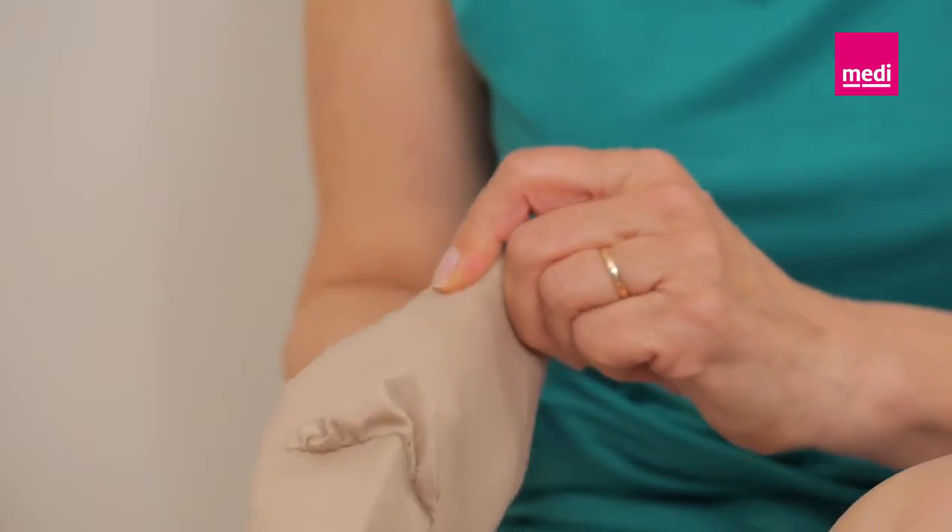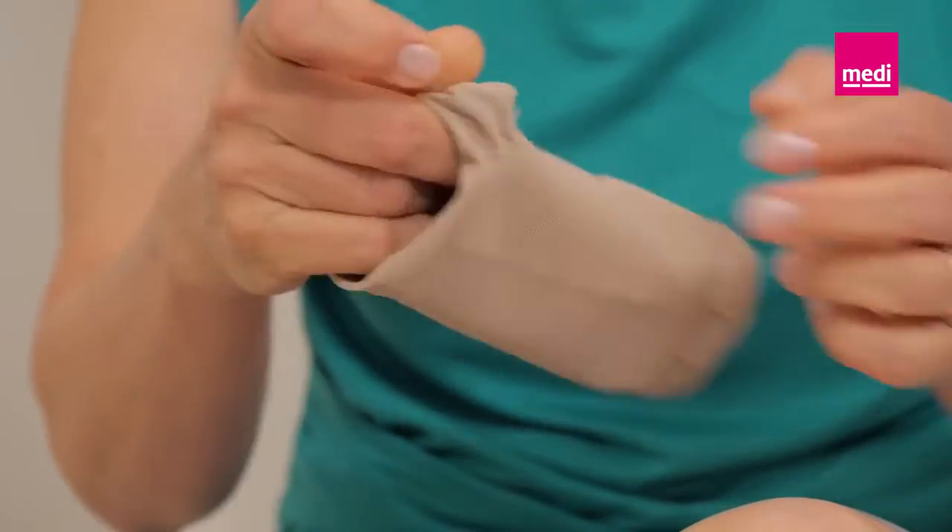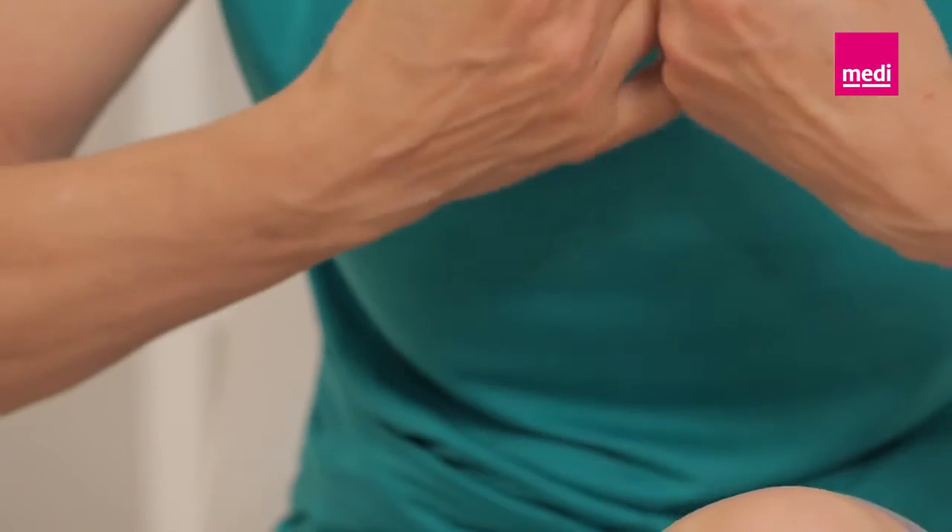For an easier application, slide your hand into the Circate Compression Anklet and turn it inside out, just up to the heel.